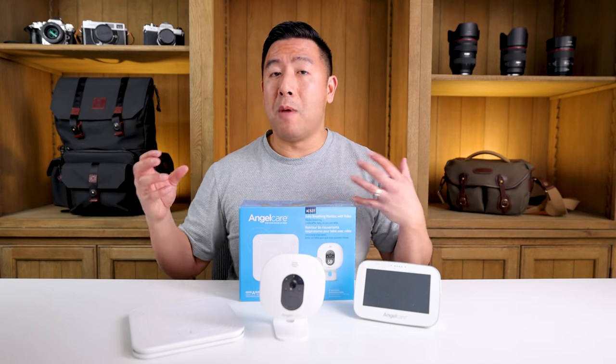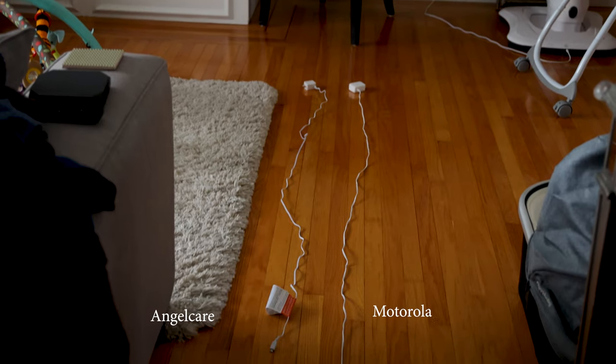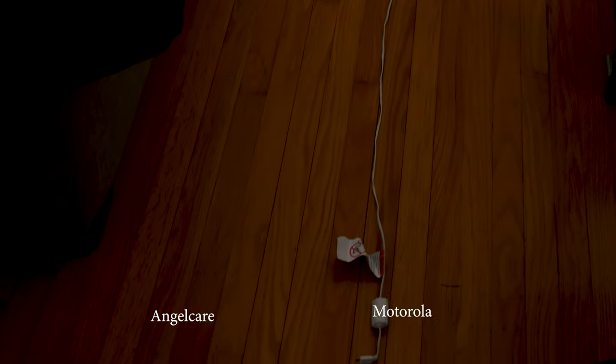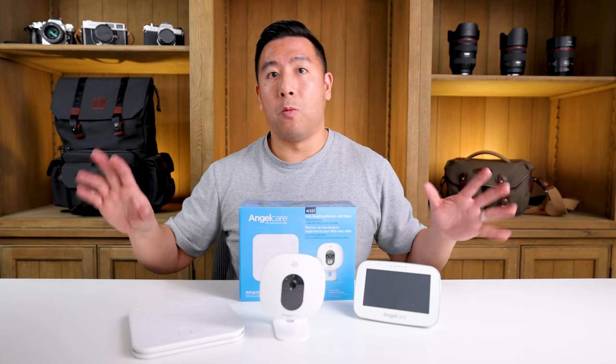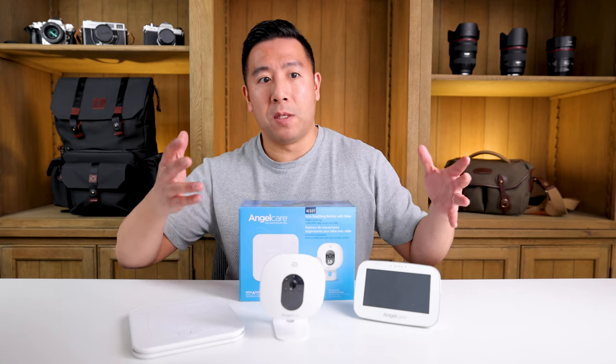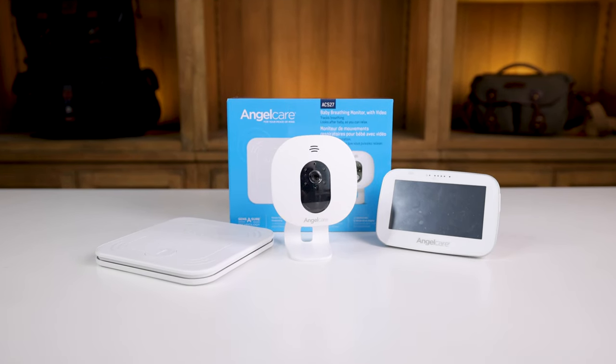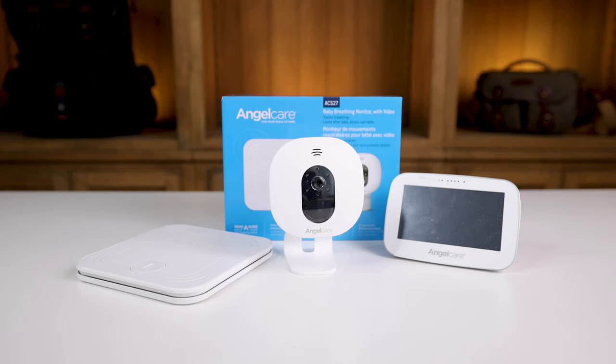I also have the Summer Infant Zoom HD and the Motorola system, and they both come with power cables that are very long — enough to stretch around your crib to reach whatever outlet you have. It was just really frustrating with the Angel Care system.